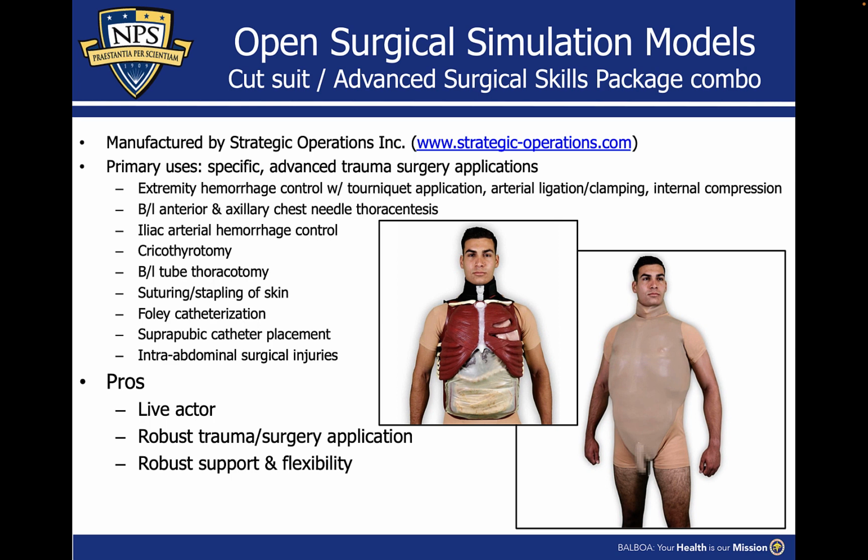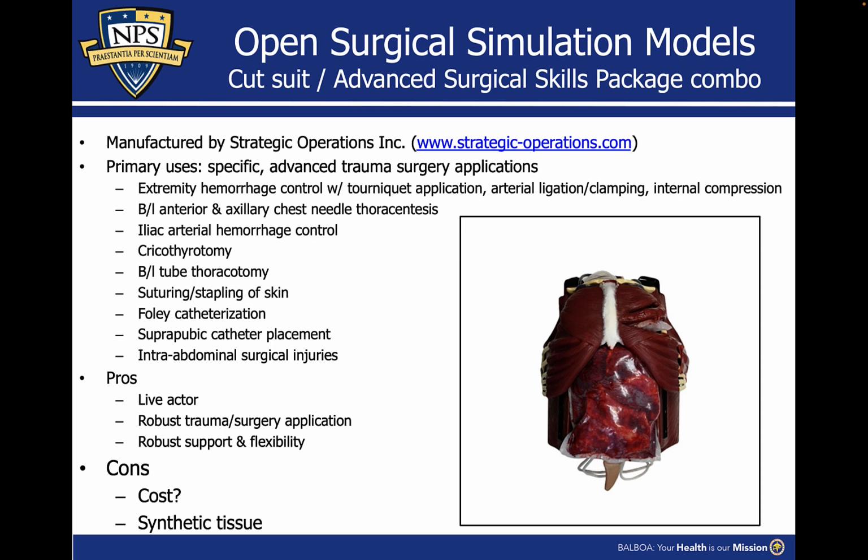Strategic Operations has a robust support operation, as well as a lot of flexibility. You can write to them and tell them what you want to try and practice or train on, and they'll develop some sort of system to place into this so that they can do that for you. Cons for this system, as well as the next system manufactured by Strategic Operations, is that it is synthetic tissue and that doesn't have the feel of live tissue as some of the live models or cadaver models will have.